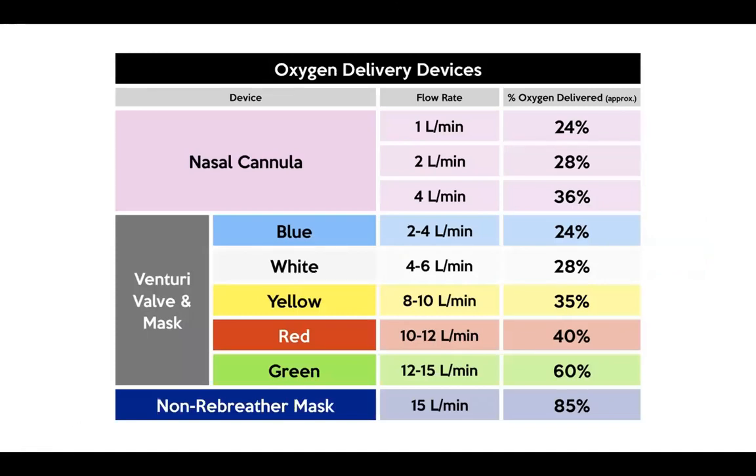Sorry, I've just got a question here. Fill the 2 mils if you can. Yes, you want to take at least 2 mils of sample, because what happens with the ABG machine, it will suck up a bit of the serum or the blood, and if you don't have an adequate sample, it can be underfilled, and you'll have to re-attend the ABG. So make sure that you have a well-filled syringe. That's a really good point.